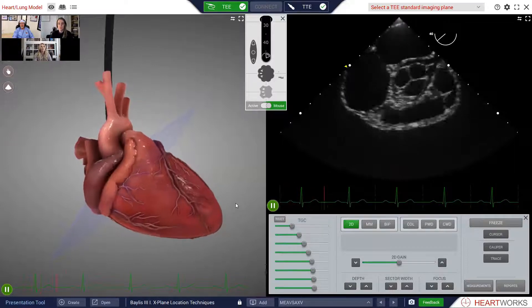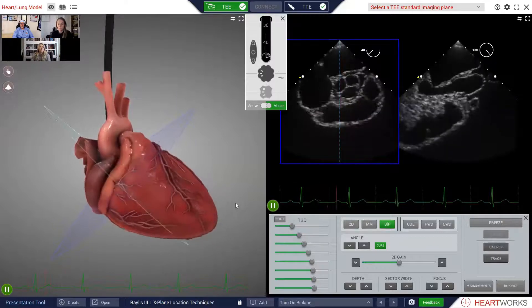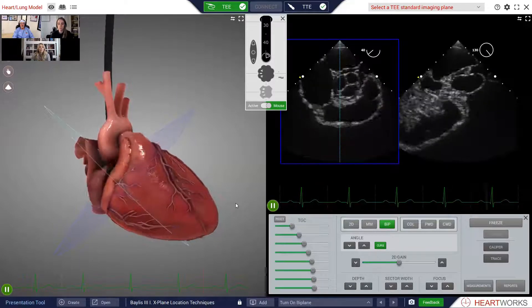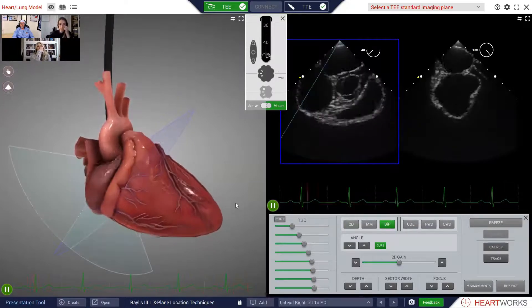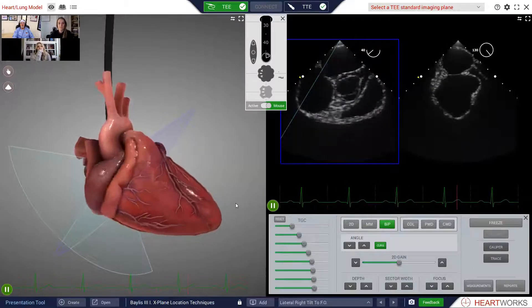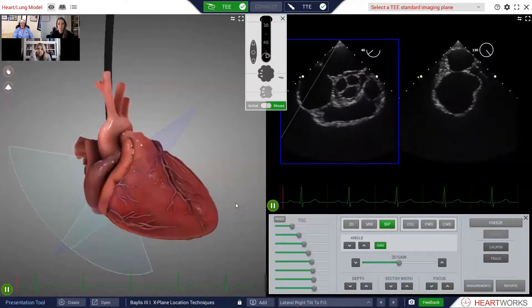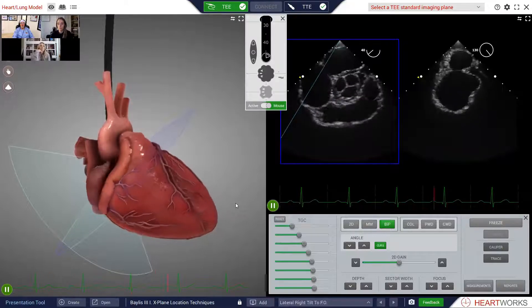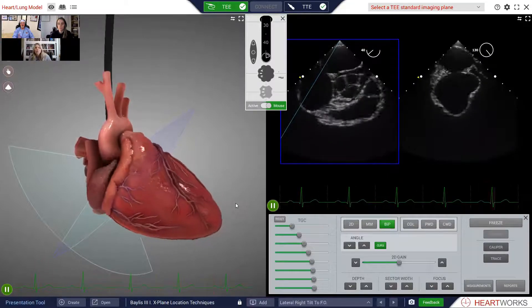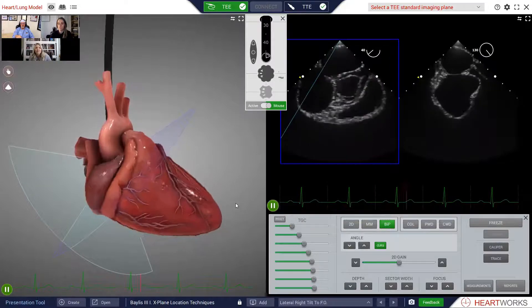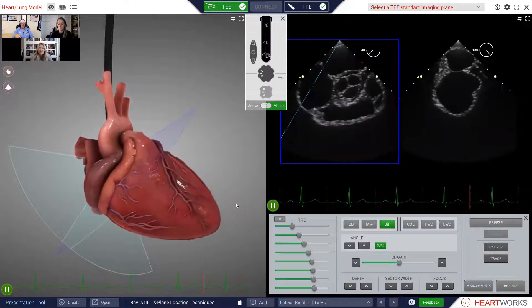Here is a short axis view, and here is a biplane with the short axis view being the primary plane. The move I just did there was a lateral tilt — I was here and I did a lateral tilt towards the patient's right side. This is kind of the reverse of what you were just talking about, Janine: instead of the bicaval view being the primary view, here the short axis view is the primary view.